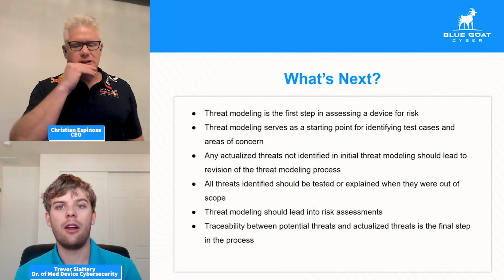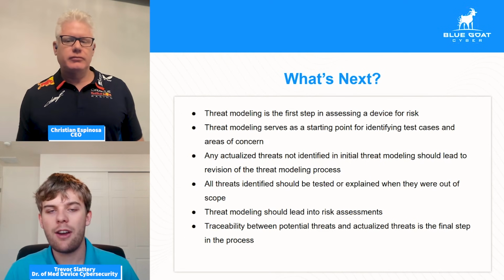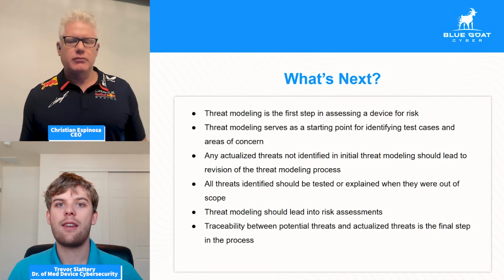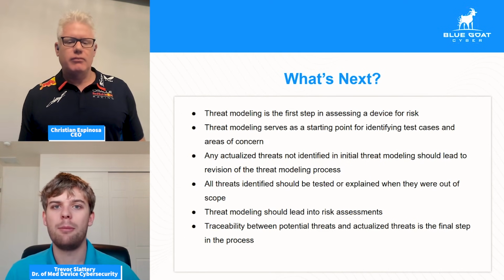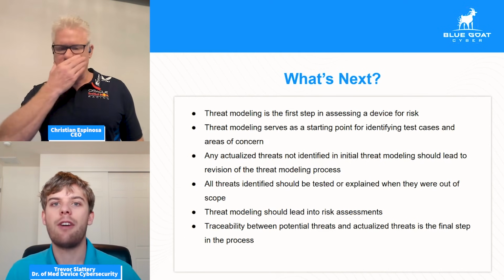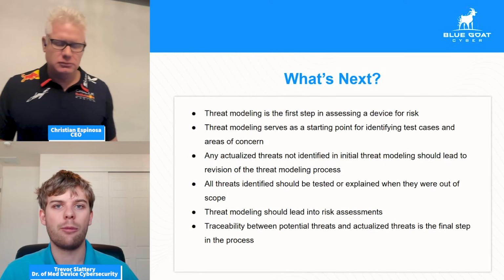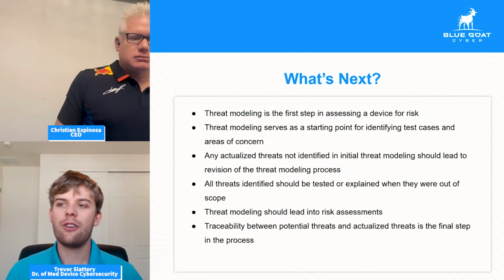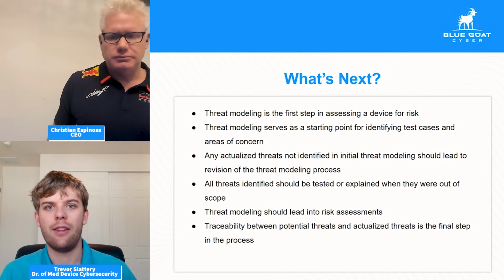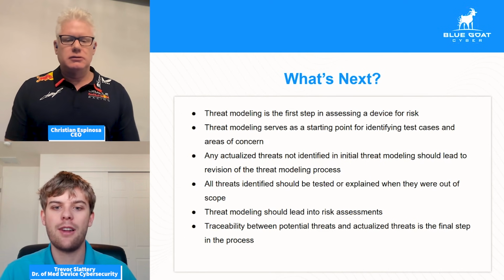Now, if we're working on a surgical laser and we find that we're able to get into the system and modify the memory and disable safeguards, that's going to be top of our concern. That risk assessment should identify that as a critical problem immediately, something that everything needs to stop. We need to find a way to design that out of the system. It's very dangerous and that can lead to a lot of harm for patients. So understanding what the actual impact is going to be, how easy it is to exploit these vulnerabilities is a very important step once we have identified what's real and what's not.